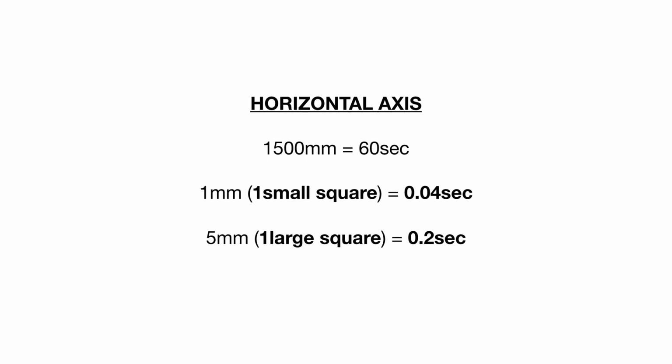The terms unipolar and bipolar leads are no more used because all the 12 leads in ECG are bipolar. There are positive and negative terminals. This lecture is just an introduction to ECG. A lot more to say will continue forward.